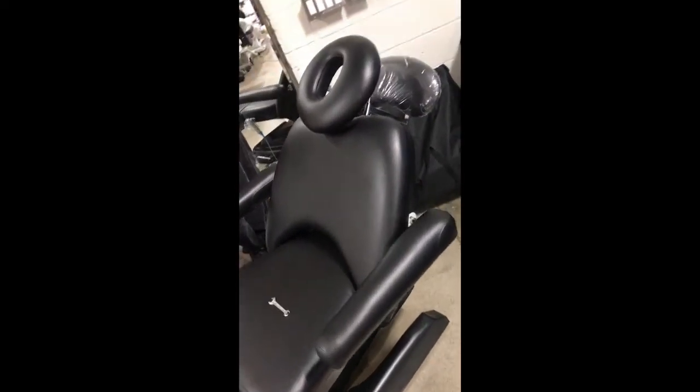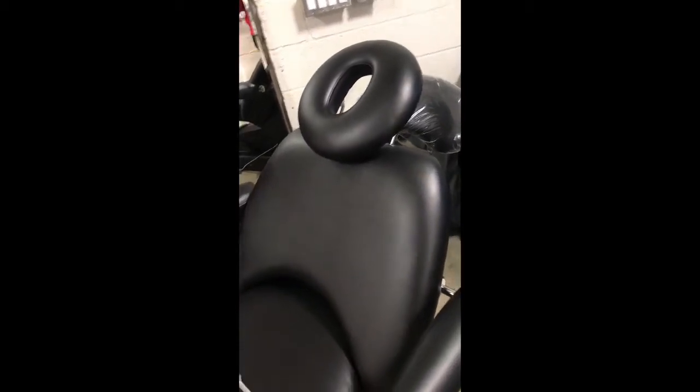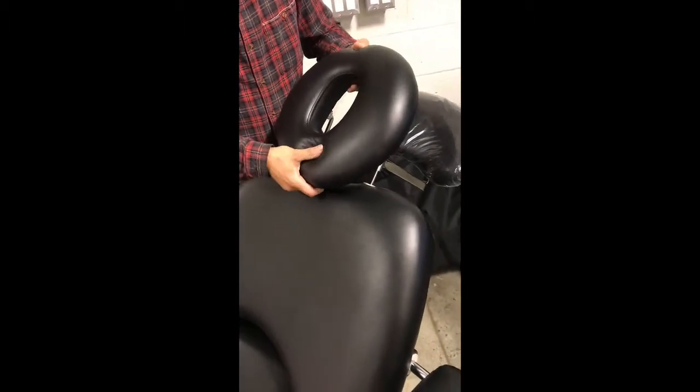Today we're going to show you how to loosen and tighten the headrest of a Monet electric treatment table. For adjustments, you have the option to adjust up and down, and you also have the option to tilt forward or backward.